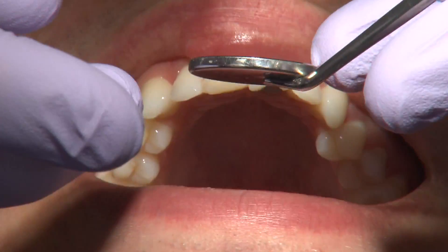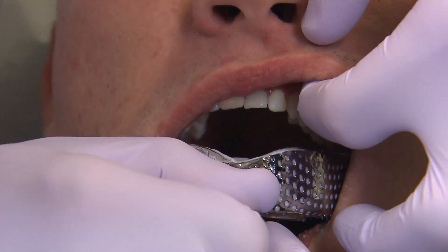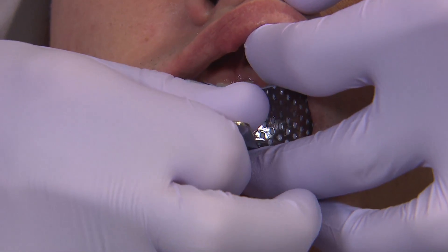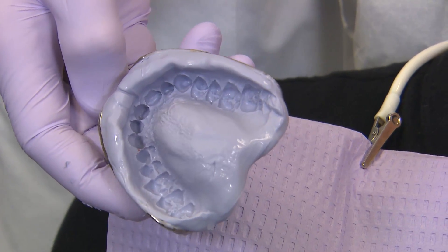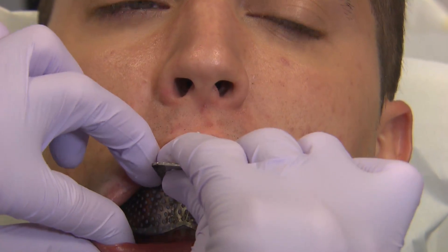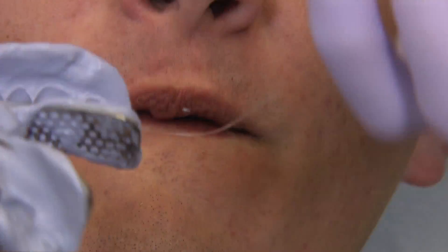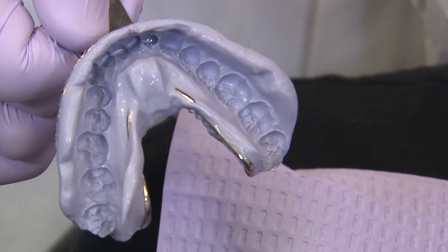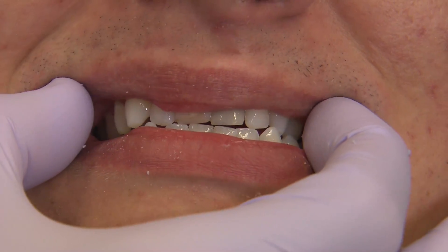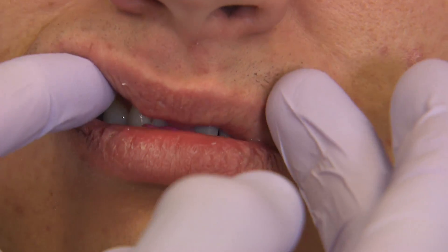We move on to final impression making for the restoration. I'm capturing an impression of the patient's full arch. I want the laboratory to fabricate a temporary for tooth number eight, go through the wax-up and temporary fabrication, and prepare number eight for a final restoration. Also notable: the patient does have a crossbite. We discussed orthodontic treatment, but at this time the patient decided not to go through with it.